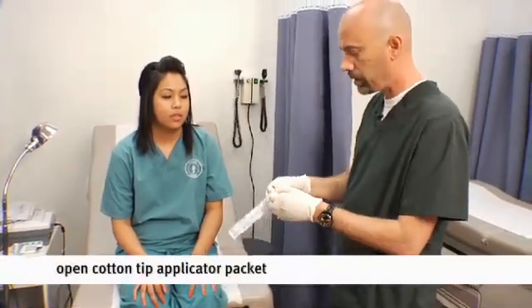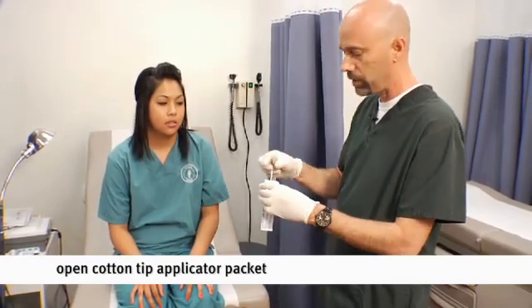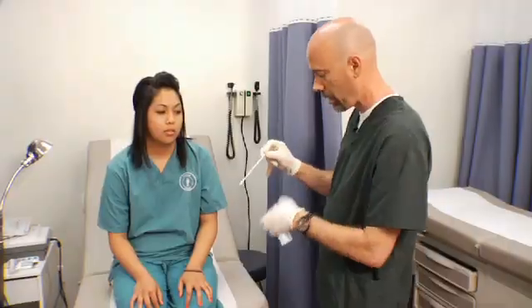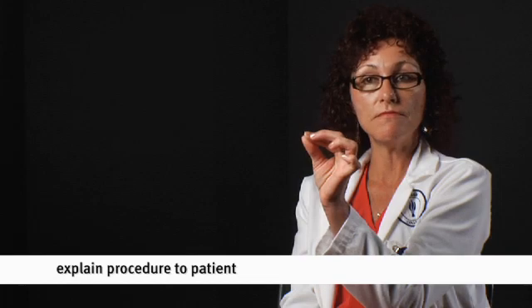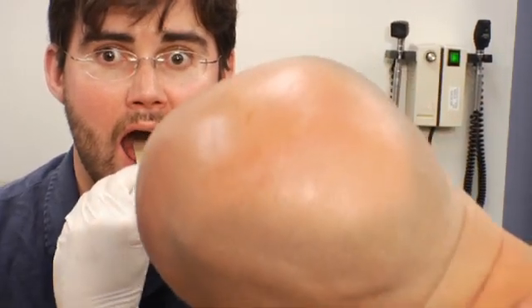We're going to open up the packet containing the cotton-tipped applicator, and remember this is sterile inside, so we don't want to touch the end of the applicator. Talk to the patient, explain to them, I'm going to swab the left and right side of your throat. It may trigger your gag reflex. I'm going to do it very quickly. I want you to open your mouth, say ah, and I know that sounds silly, but when you tell the patient to do that, their tongue actually moves down and it opens the throat. And as soon as they do that, I swab left, right, and come out.